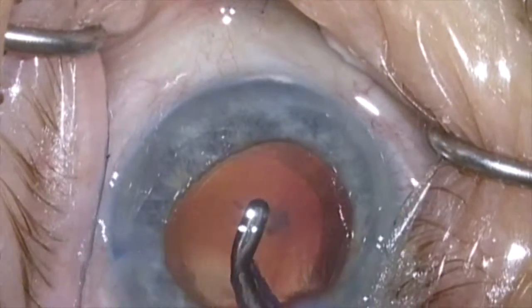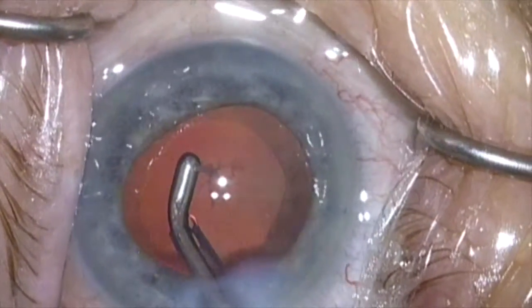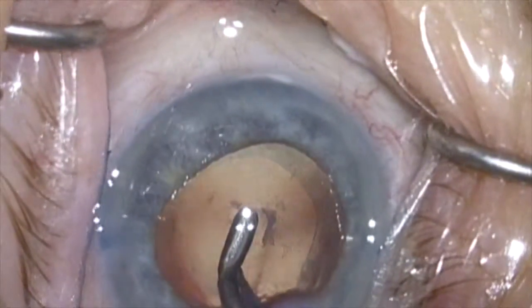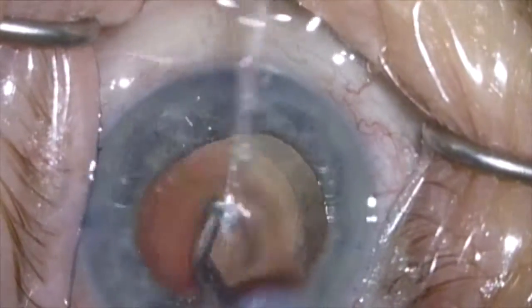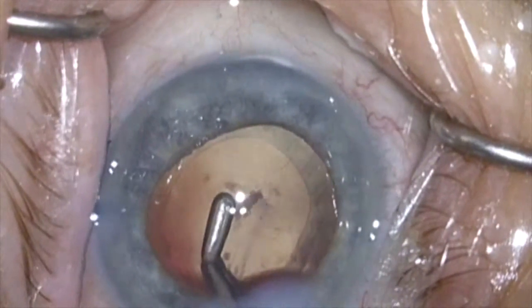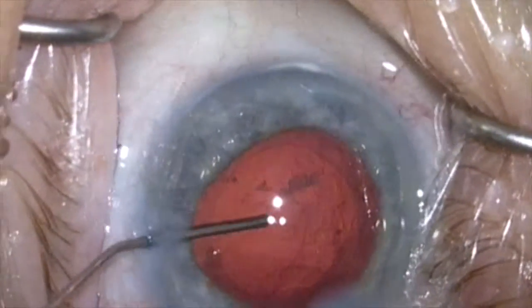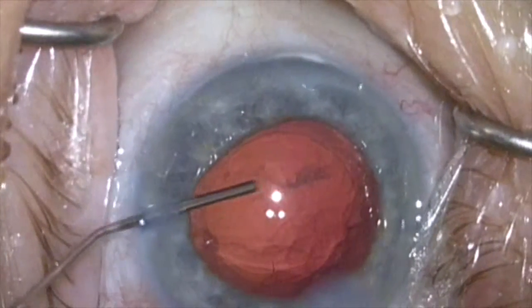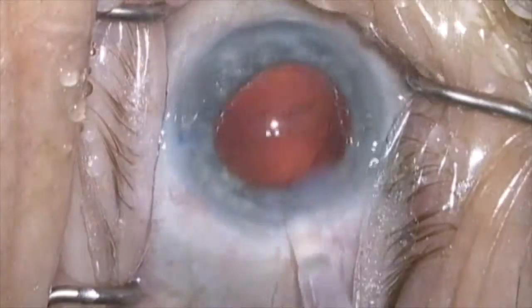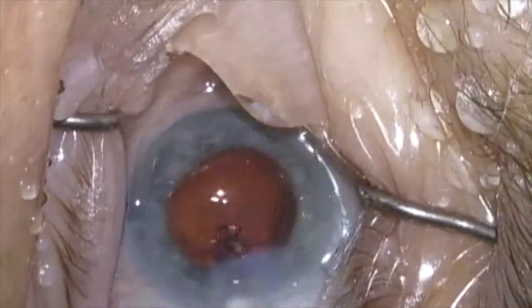When I do this I find that I'm putting a little more tension on the posterior capsule than I would like, and I'm concerned I might tear it if I get too aggressive. So I give a few attempts at peeling this off, and when I see that it's not going to be successful without putting unnecessary stress on the capsule, I'm going to put viscoelastic in place and get the lens in there before I do anything I'll regret.